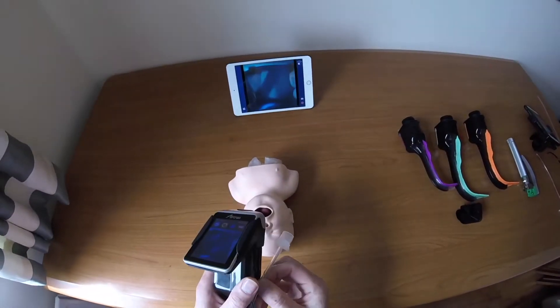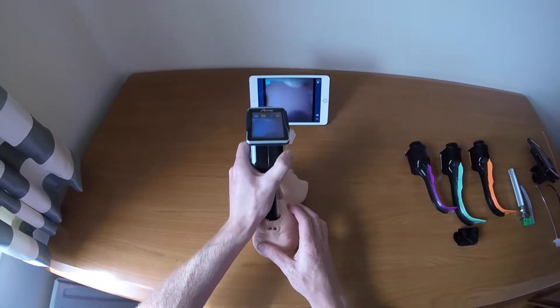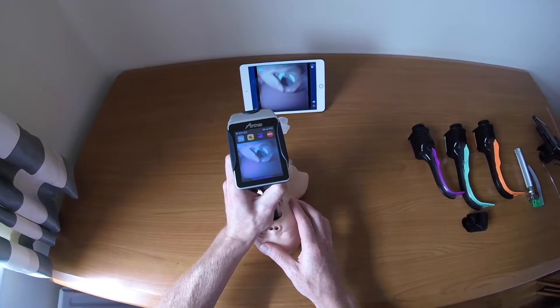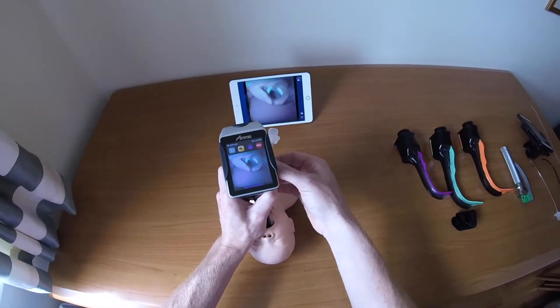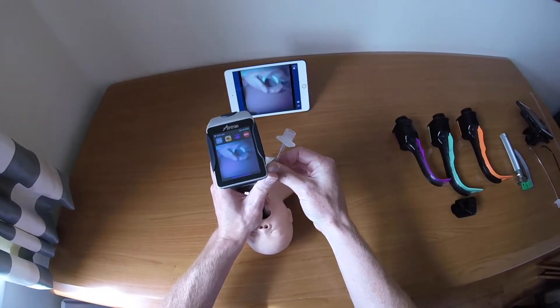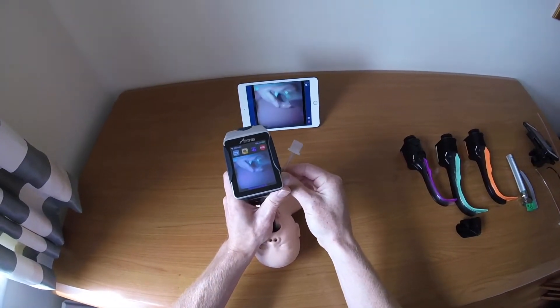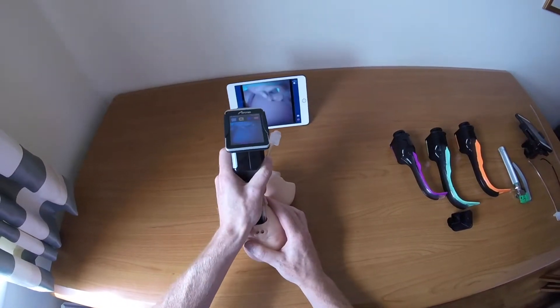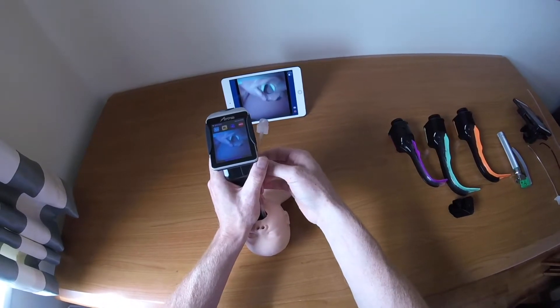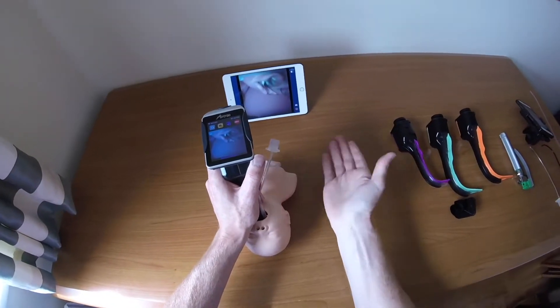A common mistake is being too close. Going right in gives an excellent view, but as you advance the tube it often catches on the cartilages and you don't have time to make the necessary adjustments. Dropping slightly back gives you more time and space to steer the Airtrack into the airway correctly.